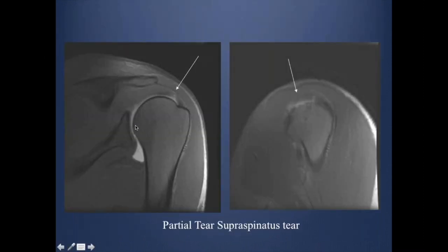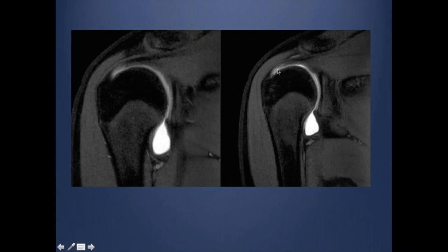This is a case of arthrogram. You can see that some contrast is actually extending through the substance of the tendon, indicating an articular surface partial thickness tear, which gives an axis for contrast to enter. Another example shows how arthrogram can be more superior in demonstrating the articular surface partial thickness tear, usually low-grade.